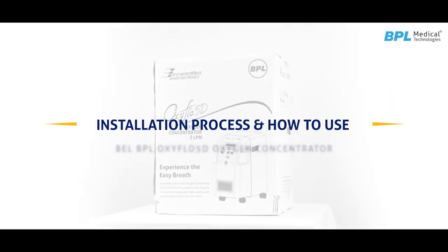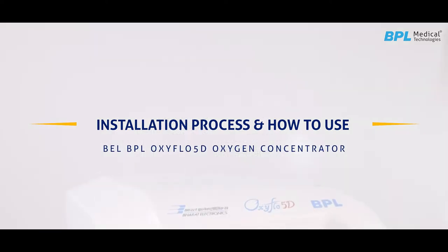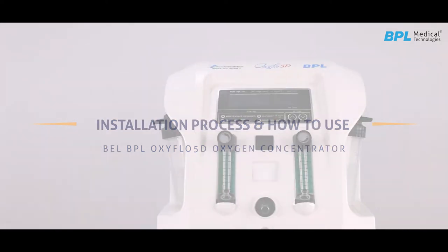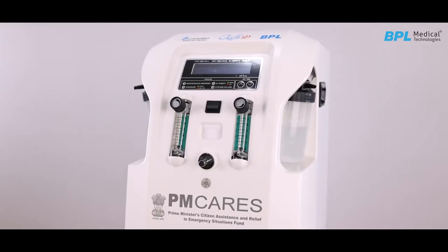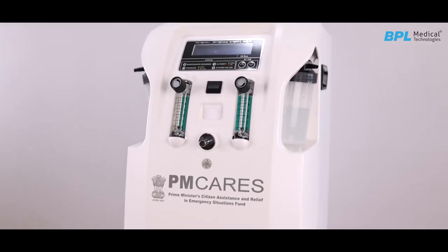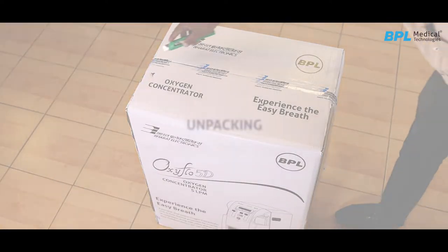Hello everyone, in this video we will look at the installation process and how to use BEL-BPL Oxiflow 5D Oxygen Concentrator effectively. BEL-BPL Oxygen Concentrator Oxiflow 5D provides up to 5 litres per minute continuous flow with oxygen concentration up to 93%.